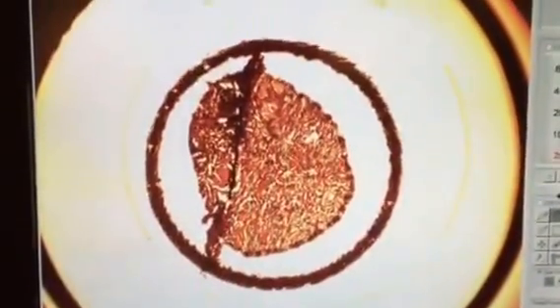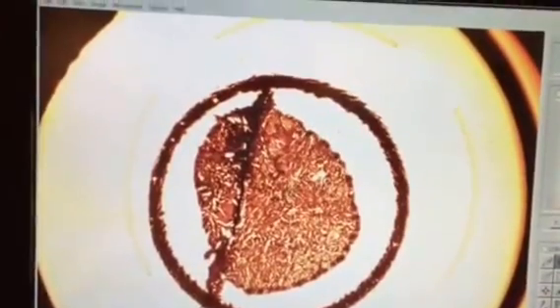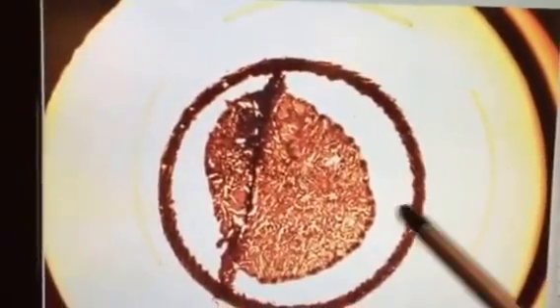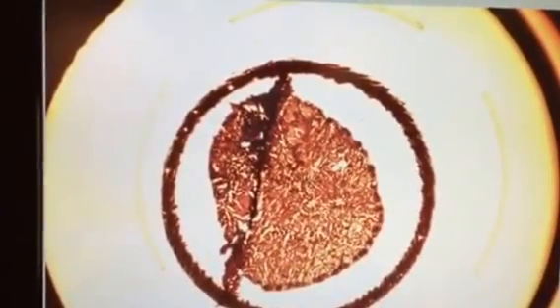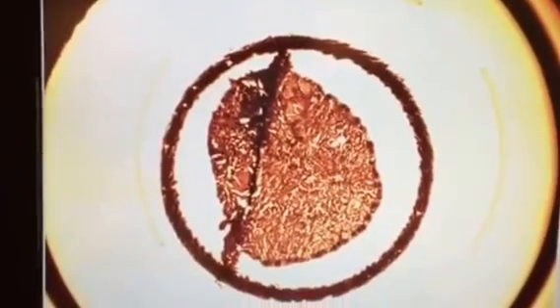The system will pick up the cap and place it at the QC station, and then at the QC station we get to see the exact tissue that we decided to extract. This is the exact size and area that we had chosen before, and this can then be taken on to nucleic acid extraction.